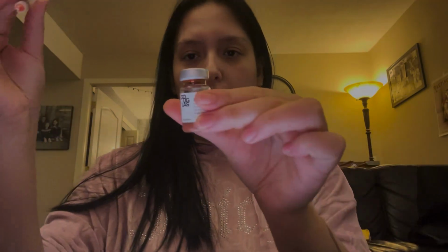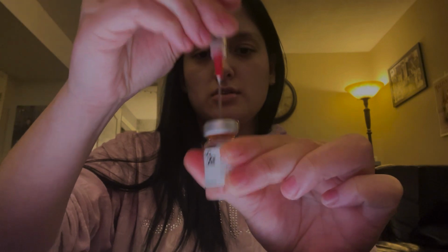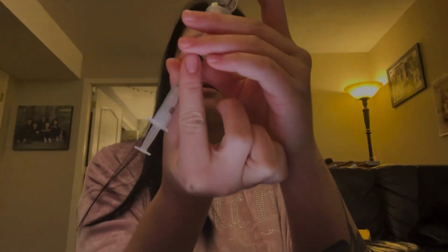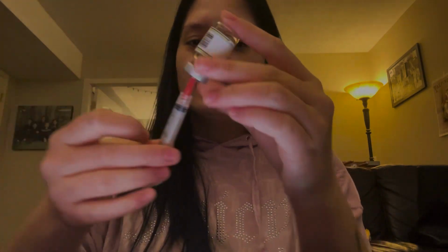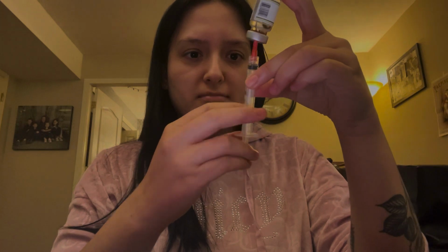I'm going to remove the needle cap. And then I'm going to draw up my medication. I'm going to put the air in. I'm going to be drawing up 0.5 mils.